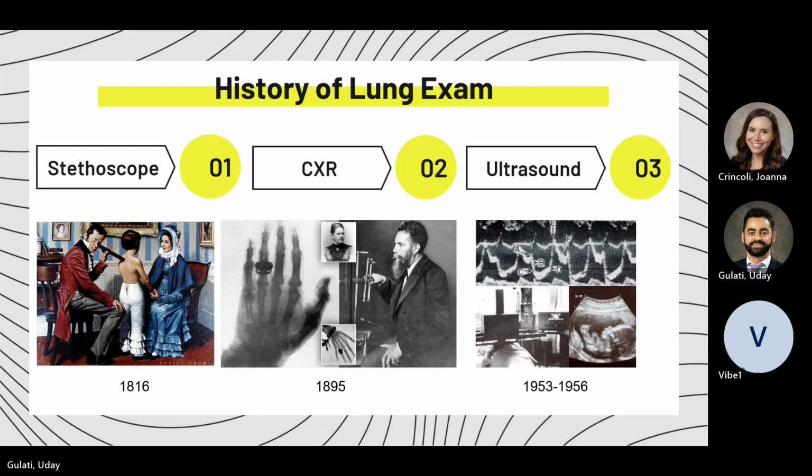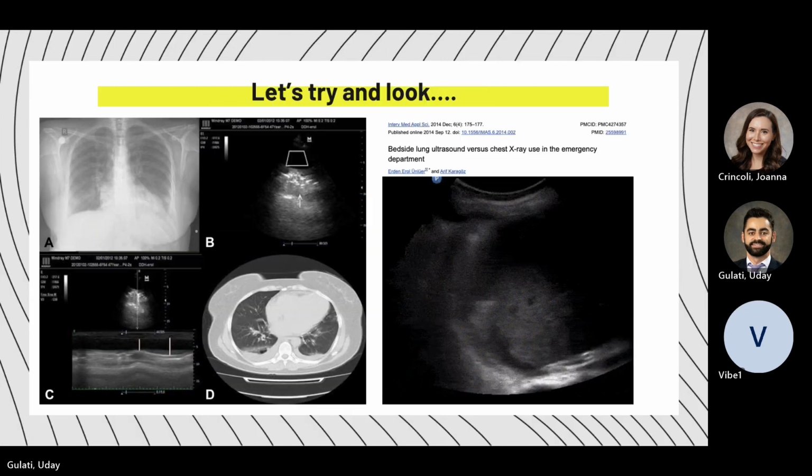And then ultrasound really advanced, not because of critical care or emergency medicine, but because in the 1950s an OB physician, Ian Donald, and an engineer named Tom Brown started using ultrasound. And they realized right away that the advancements here are not just for OB, but for lung ultrasound as well. And so this is the patient that you guys have.